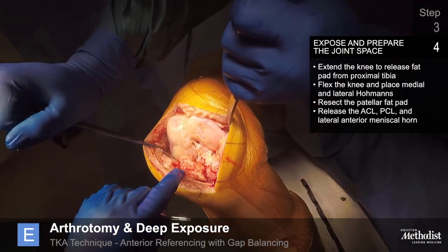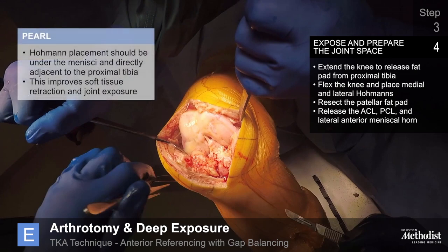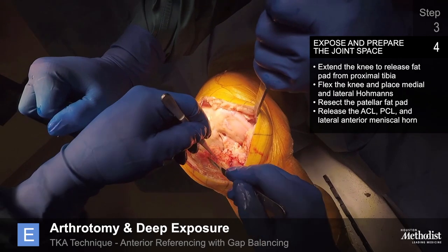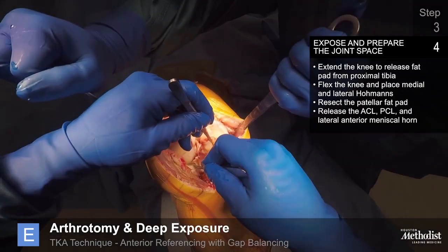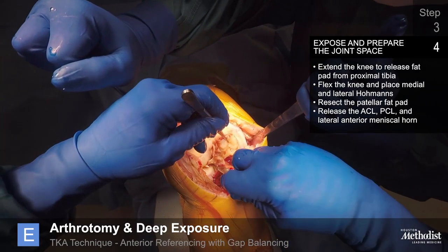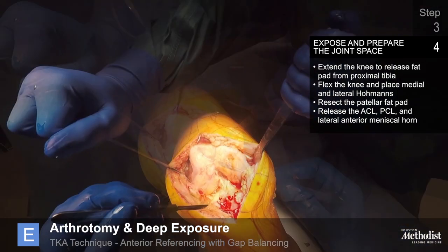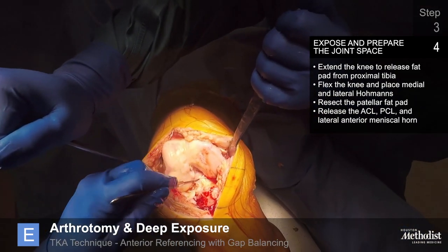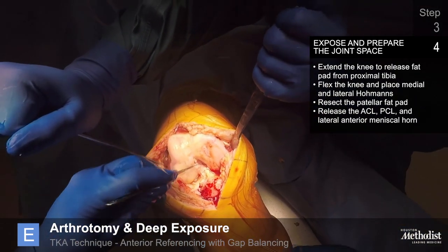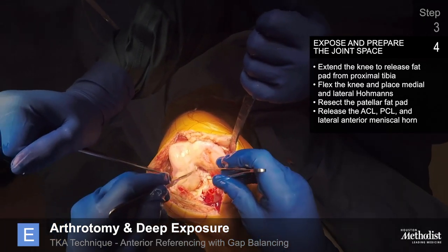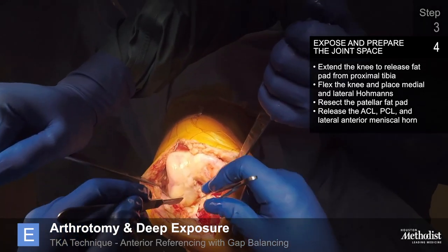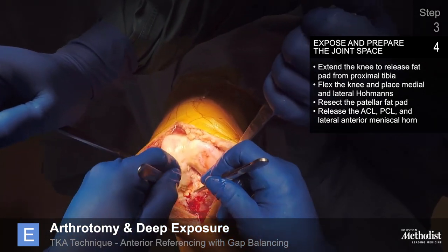Flex the knee and place medial and lateral homens retractors. Resect the patellar fat pad in its entirety. Release the ACL, PCL, and the lateral anterior meniscal horn. I routinely resect the PCL for all total knee replacement cases.